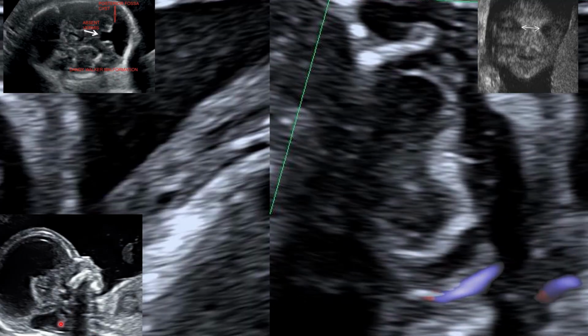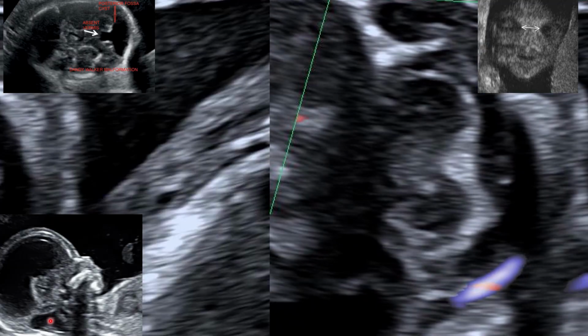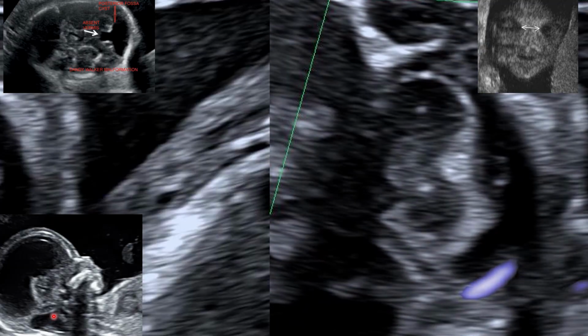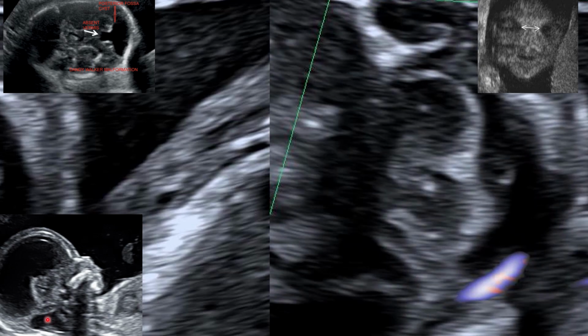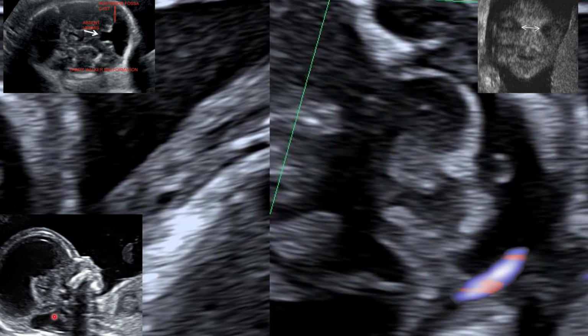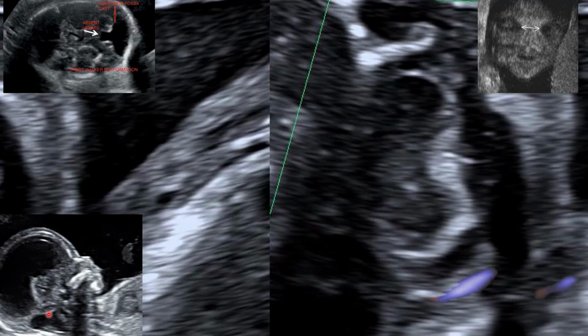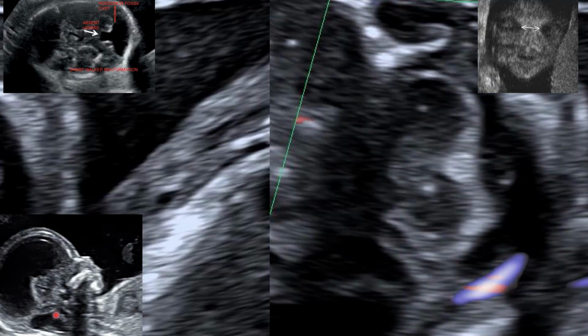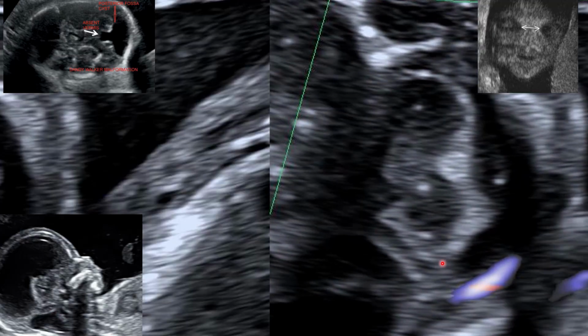You can see here again, the fluid at the posterior fossa is very much enlarged. The posterior fossa is enlarged by a collection of fluid. So this posterior fossa cyst is a sonographic sign of a Walker malformation.